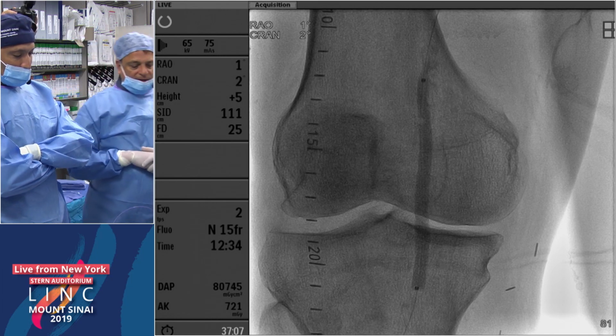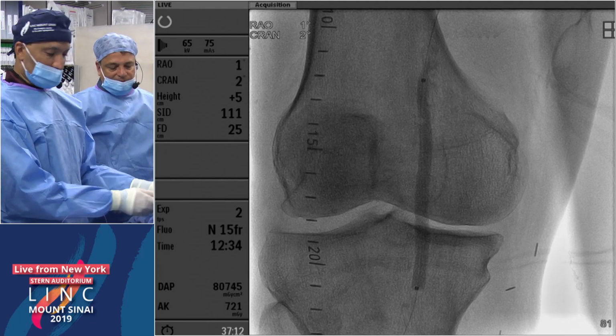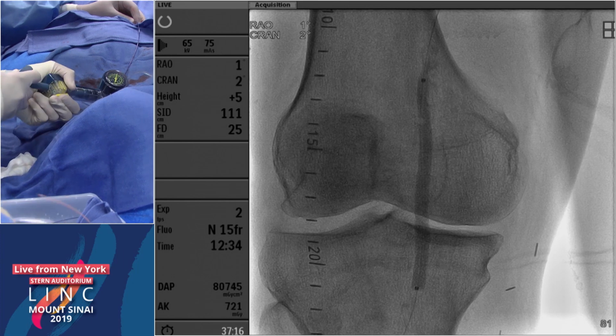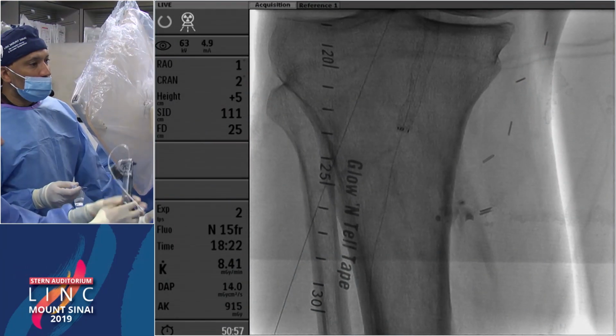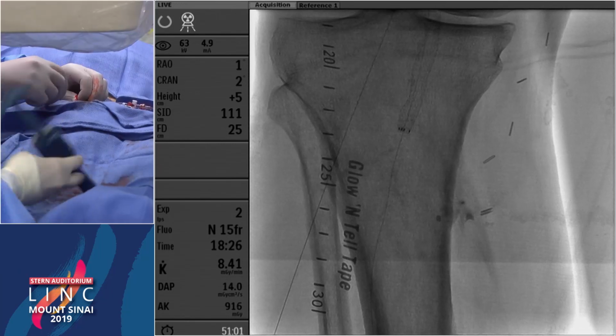Yep. So let's get a 4.0 balloon. So this is I think the situation. Wait, let's get everything ready. So PK, I think what we should do is we're going to go and give a talk, and allow you to clean this up a little bit. Right. And then we'll come back to you. So PK, you're on.